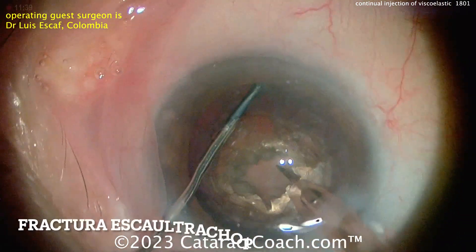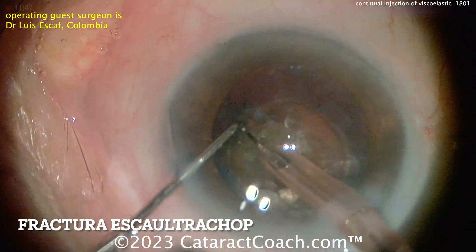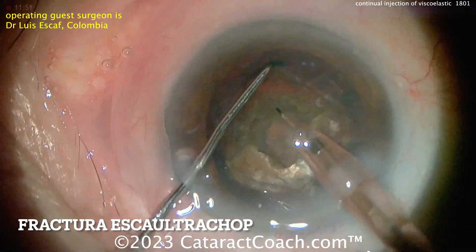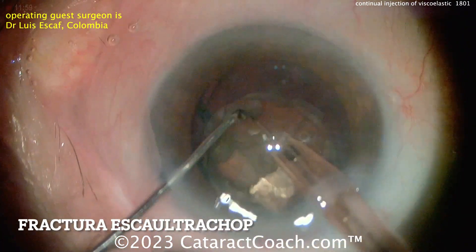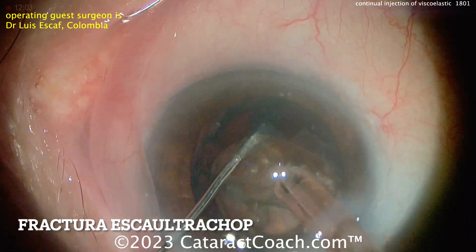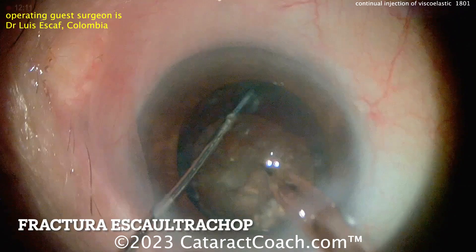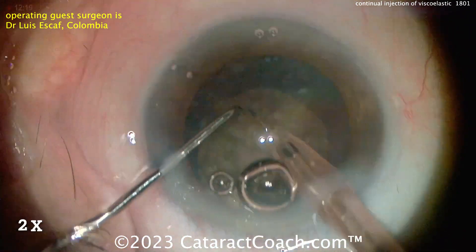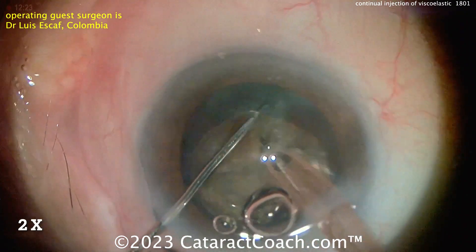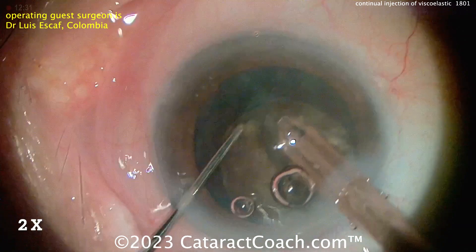And now switching over to this Ultra Chopper. This Ultra Chopper is a very sharp tip that can really penetrate into that. Notice there's no aspiration going on right now on the phaco tip — it's just this ultrasound and this sharp tip of the Ultra Chopper to go in there, followed by a regular horizontal chop. And so we're really splitting this nucleus up into nice manageable pieces. Certainly if you have a very dense cataract like this, this Ultra Chopper is a very useful technique.